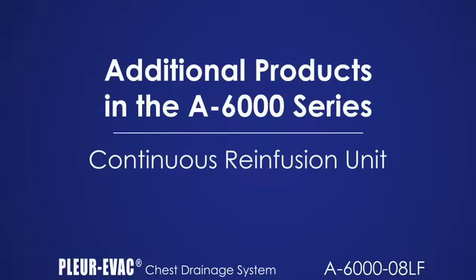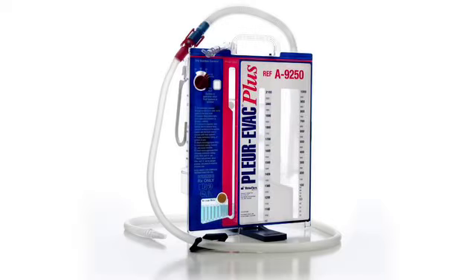The A9250-LF is a sterile, pyrogenic-free product intended for single-patient use, which is used for the collection and re-infusion of autologous blood if required. This can be primarily accomplished as a continuous re-infusion device, collecting and re-infusing patient autologous drainage directly from the filtered collection chamber via a rapid transfer bag or approved re-infusion pump. Alternatively, an auto-transfusion bag can be inserted into the patient tube for collection and re-infusion.